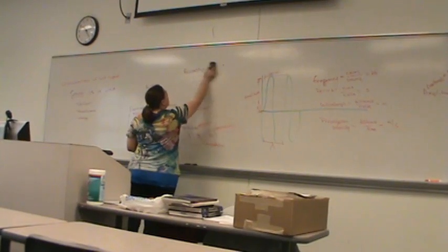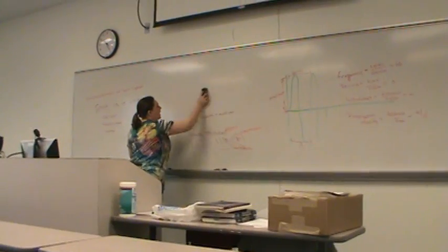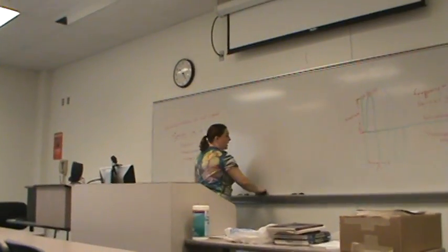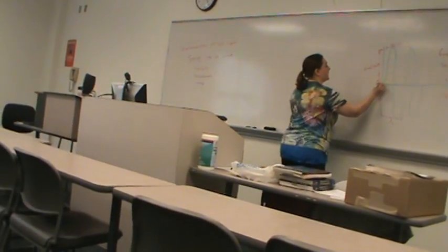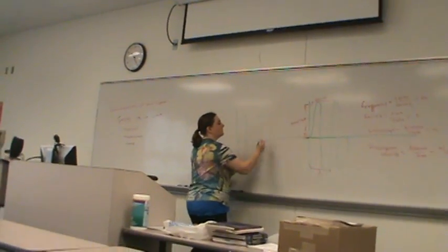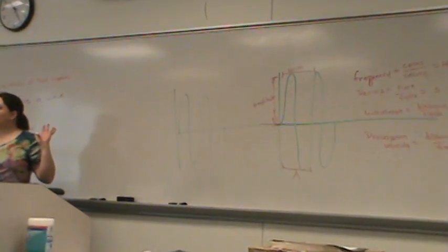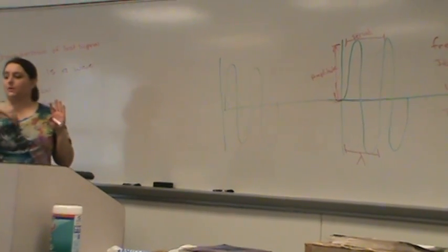So in order to have that range resolution and be able to tell what distance the echoes coming back came from and other characteristics of them, I not only have to have this idea of a wave, but I have to add the idea of pulsed wave. So I'm going to draw this way with it and draw another pulse. So now instead of just having one continuous signal, I have broken that big long ultrasound beam up into chunks, and I'm sending out those chunks and then waiting for echoes to come back.